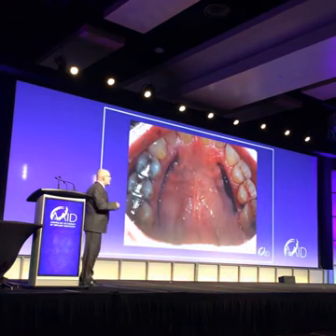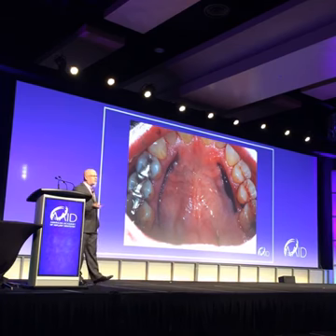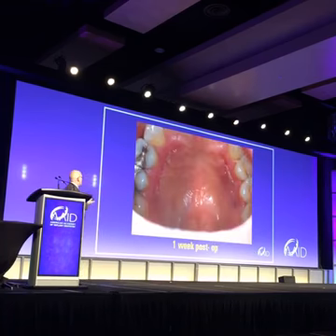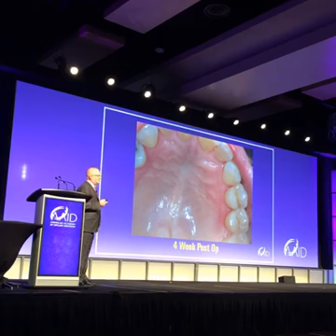I like it so much, I said, well, what if I try to do it during connective tissue grafts so I can avoid doing sutures? So this is a case that I did. First one, I didn't get any calls. The patient didn't call me. I give everybody a palatal stent. A week later, it looks like this. Four weeks later, it looks like that. Healed in, beautified in. No stitches put in. Again, using laser physics.